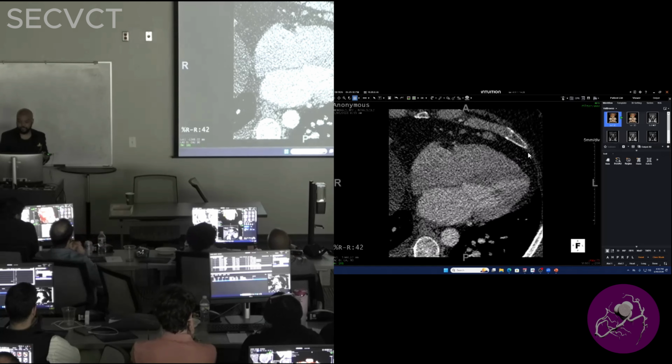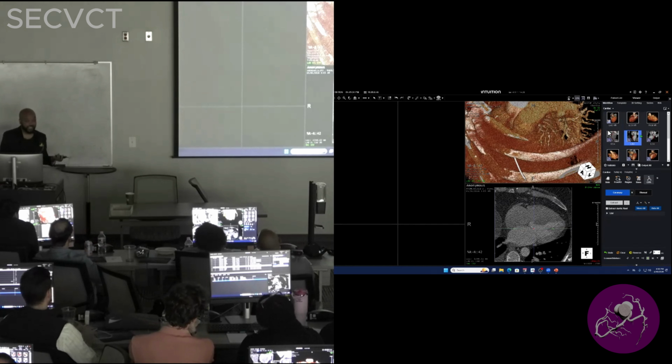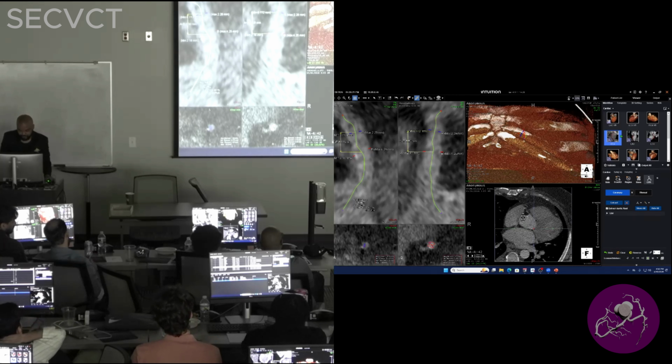And we can kind of load this up in the cardiac workflow to show you that briefly. So when I told you guys earlier about establishing dominance early on, I generally try to take the RCA first. One, because that's going to be what most people are, right, dominant. But two, that's the vessel I find to be most compromised by motion and artifacts. So if I can look at that first when my tech might call me and say, hey, is this study good enough to read? I can generally say first off, okay, looking at the RCA, do I have any motion? Are they too tachycardic? So yeah, it's barely registering this as the RCA due to the amount of motion and due to the poor opacification of this vessel. With the motion there, it's able to track the proximal, but then you essentially lose the vessel.